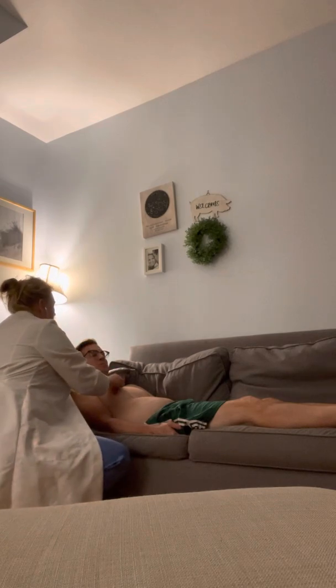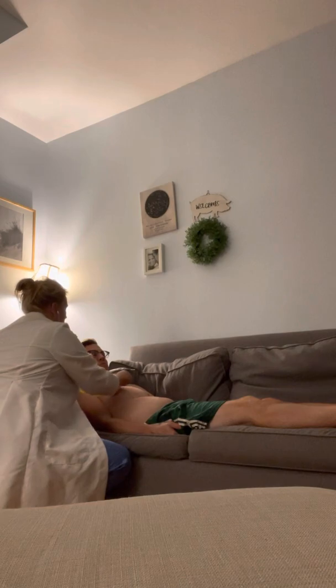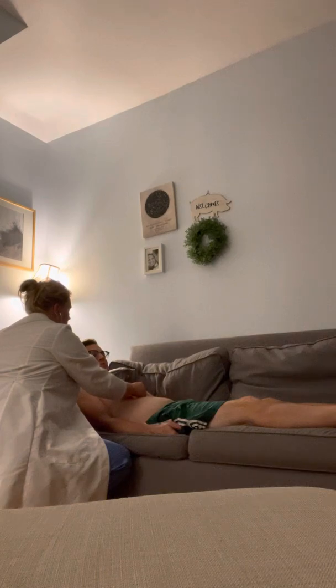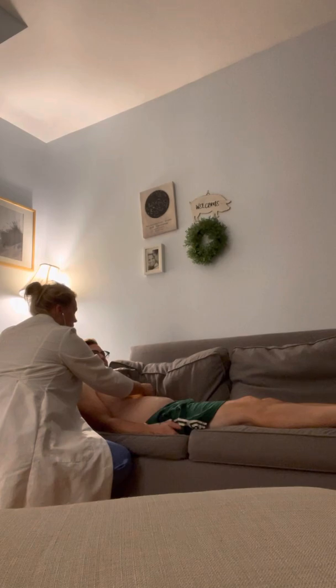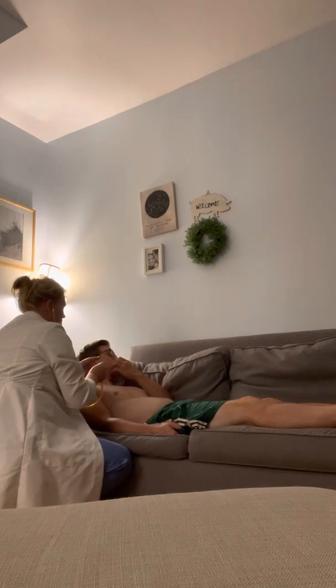So starting with the aortic and pulmonic, Erb's point, tricuspid, and mitral. And over this mitral area is where I would listen for an apical heart rate as well. And then we're going to switch to the bell of the stethoscope.